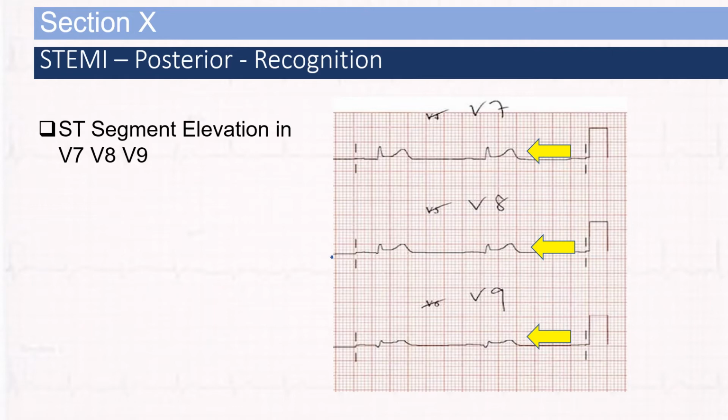There's nothing worse than showing up to an emergency department with 4 or 5 12-lead EKGs, and you've done everything that you were supposed to do, and you've done your right-sided or you've done your posterior 12 leads, and you can't determine which is which. So as soon as that comes out of the monitor, you need to be on top of that with a Sharpie or a black pen and write that in large letters so it's distinguishable from the other 12 leads.